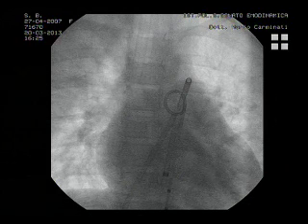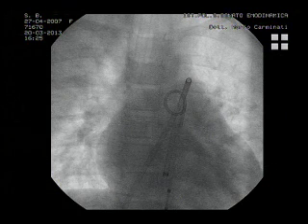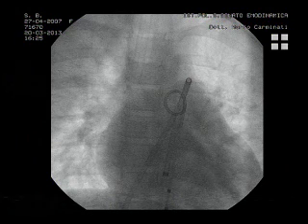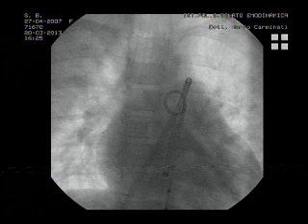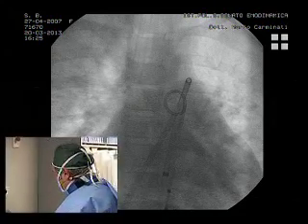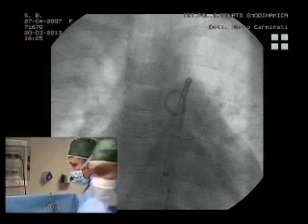Yes, that's right. It's just a matter of the morphology and the size, which is borderline between 6.4, 8.6. So why don't you give me an 8.6 ADO1 and load it and see what's going on.